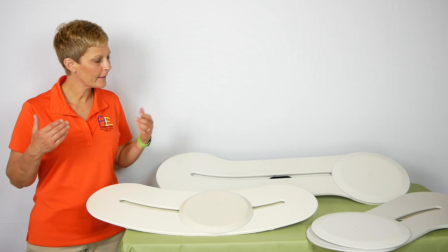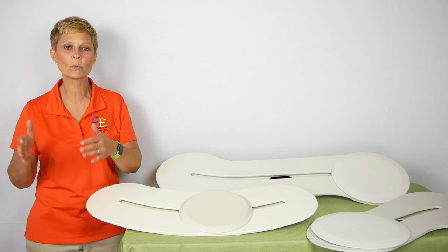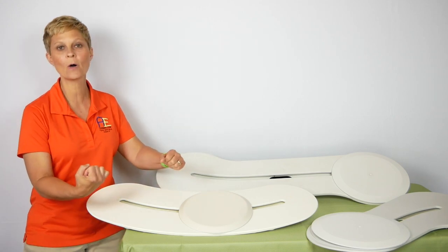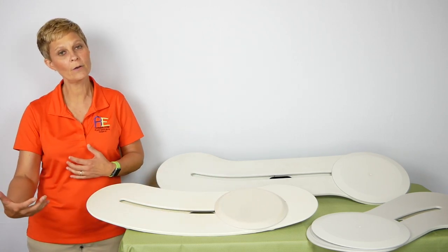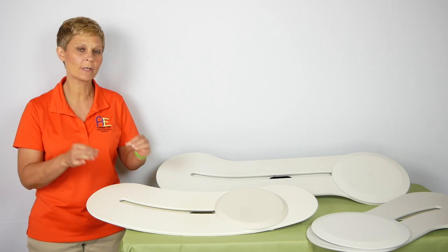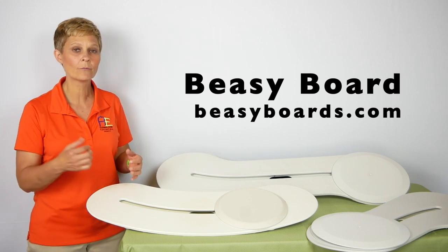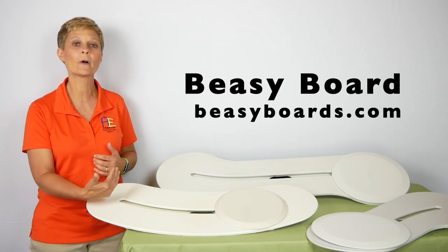So that was a Beasy Board transfer, and I do like this product — especially for caregivers doing a lot of work getting their loved one from one surface to another. This really reduces friction and reduces caregiver workload, since you're moving the person on the disc across the board rather than physically sliding them. You will need to practice with these boards. They are a little bit heavy for individual use, but many people could use them independently as well.